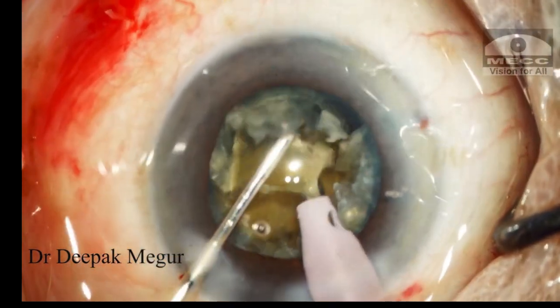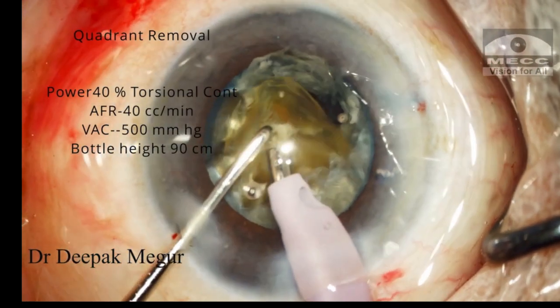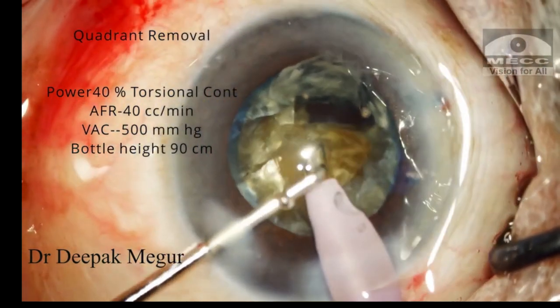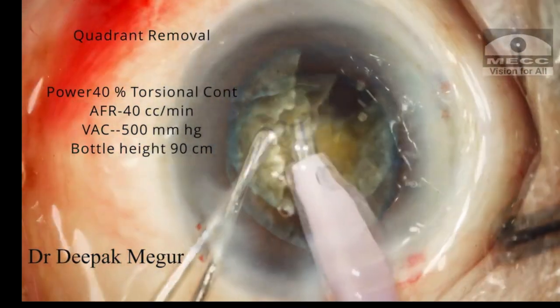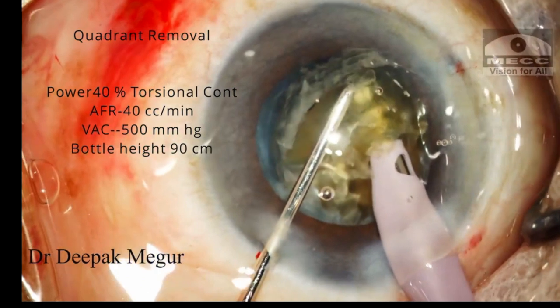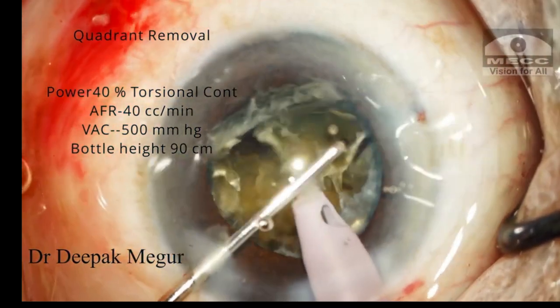One of the primary concerns while dealing with such cases is the corneal endothelium. Two factors are critical which predict the amount of endothelial damage during emulsification: the amount of turbulence generated inside the anterior chamber and also the plane of emulsification. These are the two critical factors which decide how clear the cornea is going to be on the first post-op day.